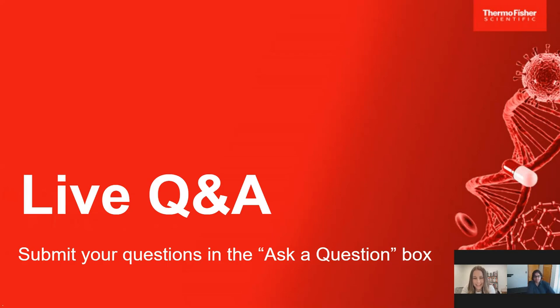Thank you. Another question. What is the key thing to follow in multiplexing if the spatial location of the two antigens is the same? Yeah, that's a very good question. If you are doing multiplexing and your targets are in the same subcellular location, you should know the abundance of the target.